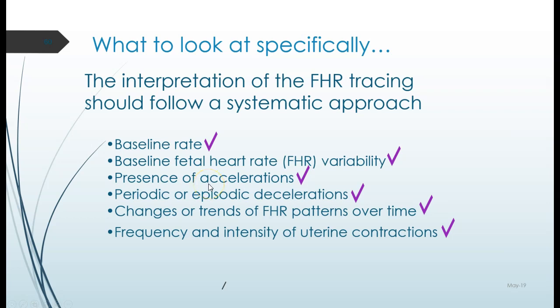Do you see an increase in that heart rate? At least 15 beats above its baseline for at least 15 seconds. Do you see periodic or episodic decelerations? Can you tell me without looking back in your notes right now, what 2 patterns are periodic and what pattern can be either periodic or episodic?